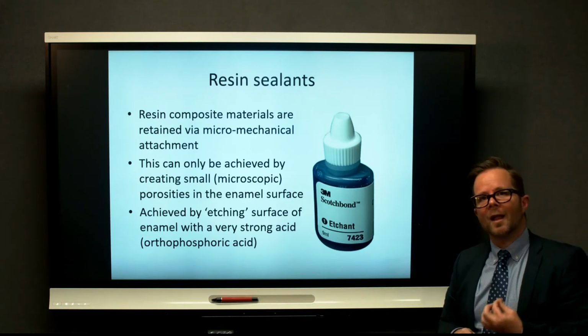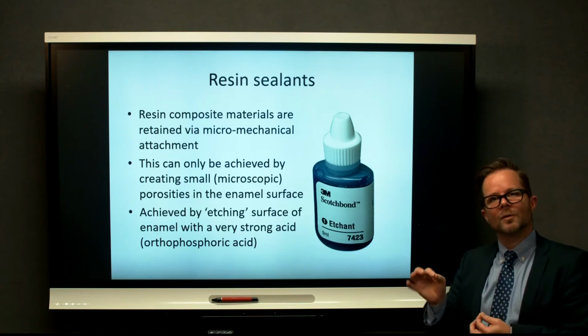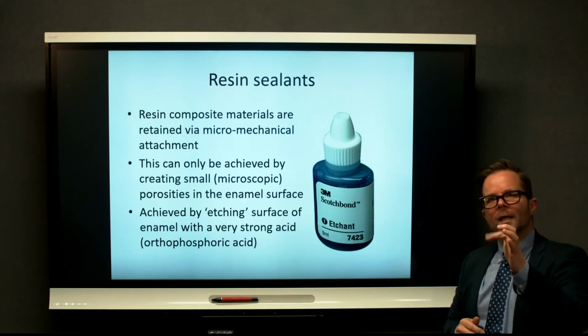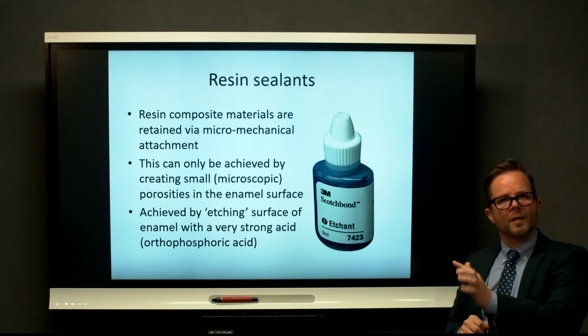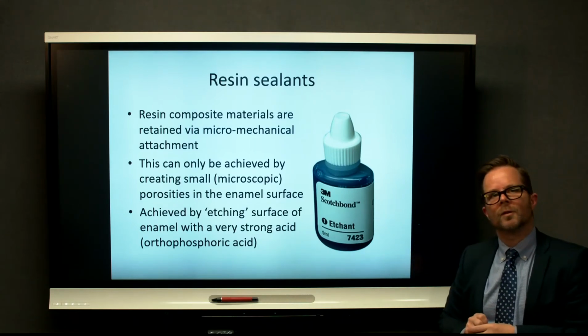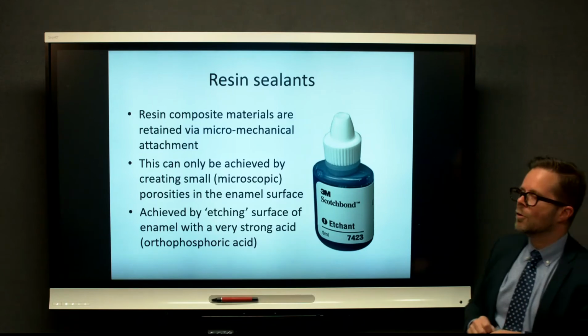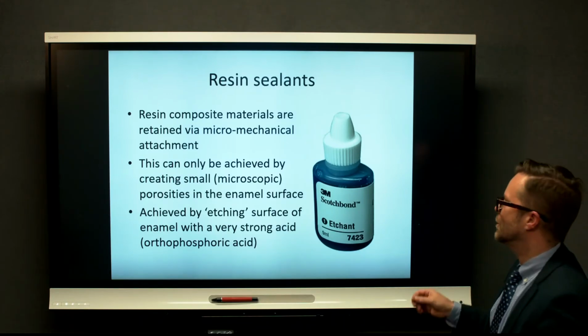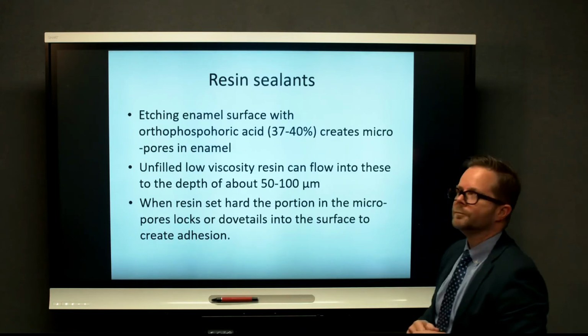If you've ever seen glass that has been etched by an acid with a picture or a name on it, and you run your finger over the area that's been etched, you'll notice that it is roughened. Okay, that's what we're doing with this etch. It's extremely strong and extremely dangerous, so we'll very carefully introduce you to this material before we use it.